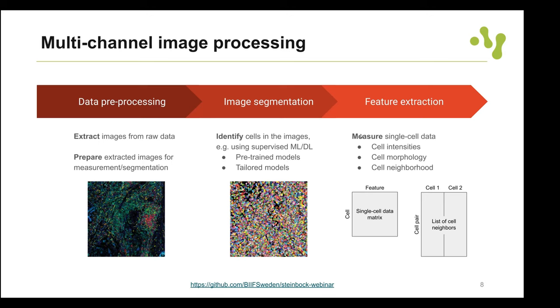After executing the pre-processing command and looking at our data folder, a new image folder is created. Steinbock always works in batch mode, operating on multiple images. Looking in the raw folder there are multiple MCD files, and from these it extracts TIFF files. You also get an output showing what Steinbock actually generates.